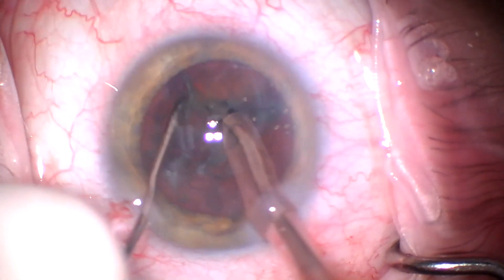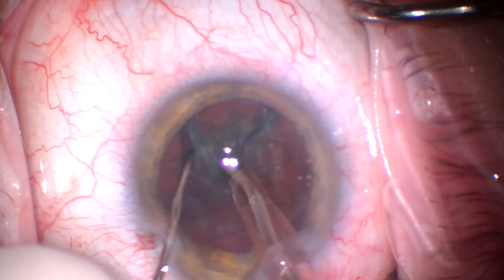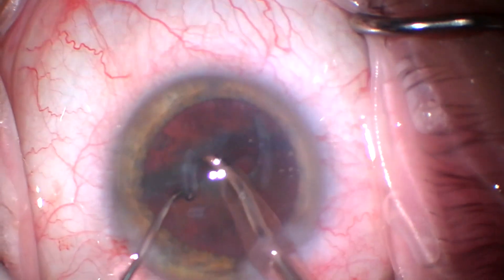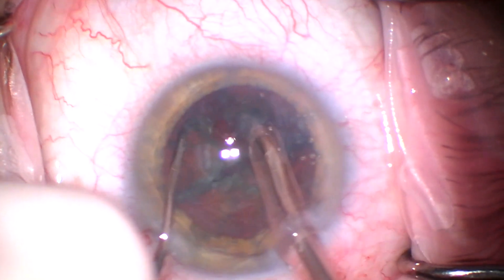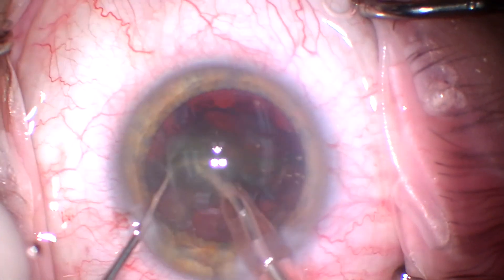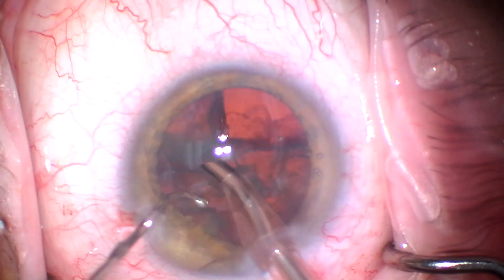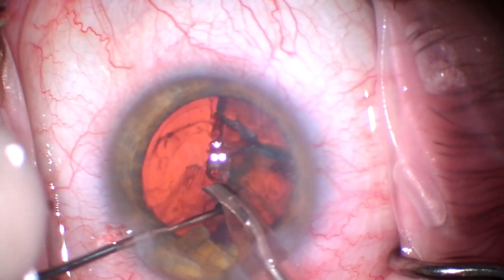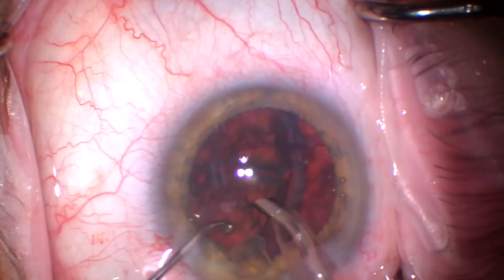Here we're splitting this hemi nucleus. Again, we've used virtually no FACO energy with a good viscote fill in chop mode — it takes virtually no energy to chop this lens. I really do feel this is a far superior technique to so-called sculpting or divide and conquer, and with high vacuum on the Centurion we can easily get rid of this nucleus efficiently.